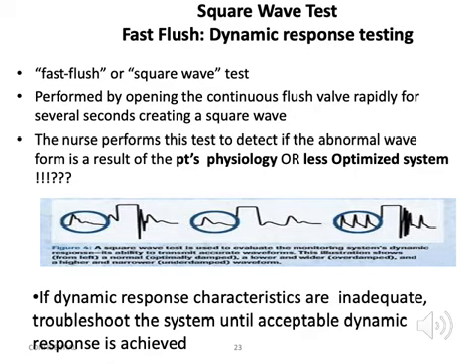هلا إذا زي ما انتم شايفين بالفيجر نمبر 2 ما في عنا oscillation بعد السكوير ويف، هذا بيكون non optimized، وهلا رح نحكي عنهم. أو إذا كان في عنا too many oscillations، لأنه الأوسيليشن لازم تكون just 2 to 3، ممكن يكون more than 2 oscillations and this is again non optimized system. إذا كان عندنا non-optimized system we need to make sure that the system is optimized. وهلأ بالnext slide رح نحكي كل وحدة منهم what does it mean وشو هي most troubleshooting اللي بتكون related to this abnormality.